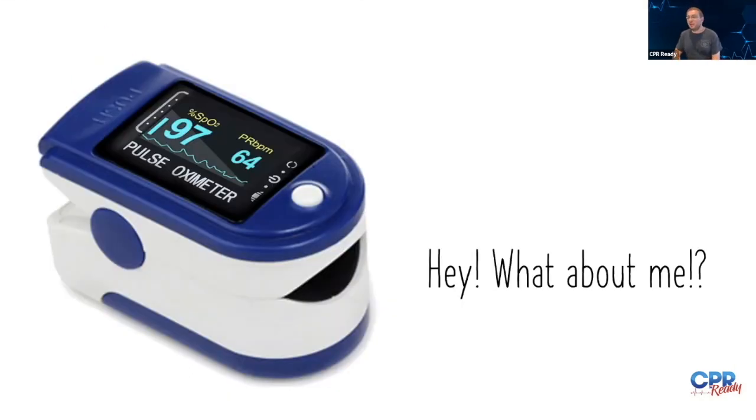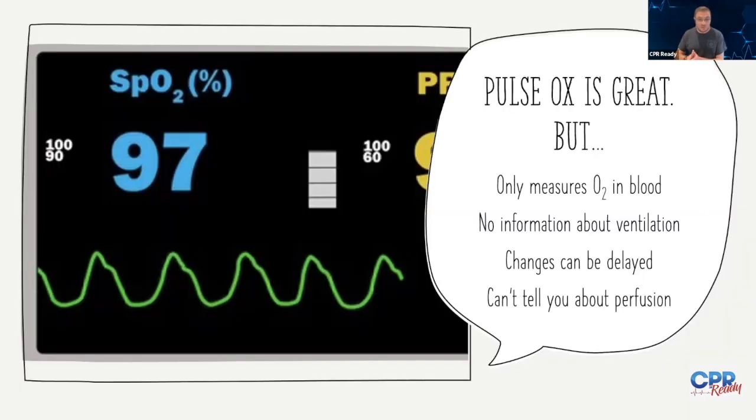So I usually get questions about pulse ox, because in some ways these seem almost redundant. So what's the point of pulse ox if I'm going to tell you that capnography is such a valuable piece of information? And it really is great. And what I want to emphasize is that capno does not replace the pulse ox.